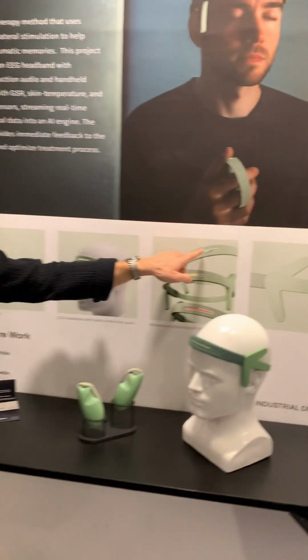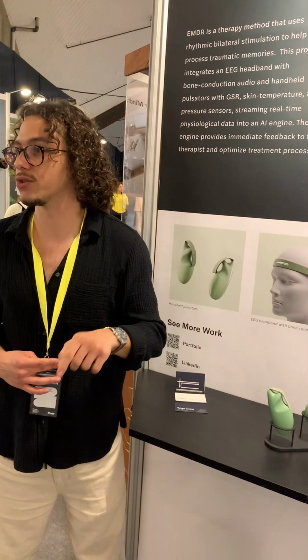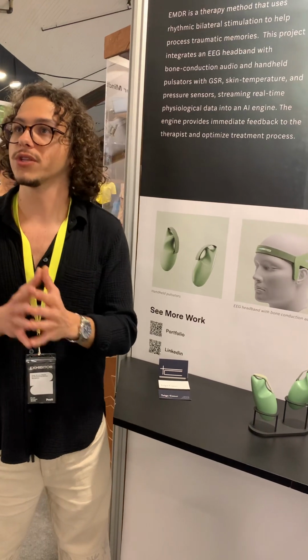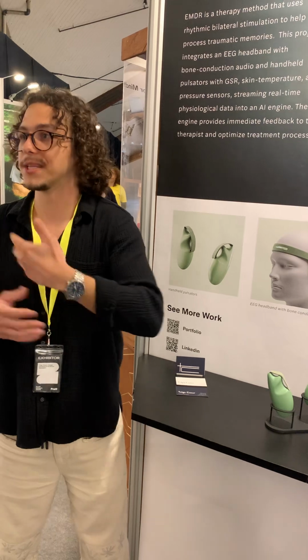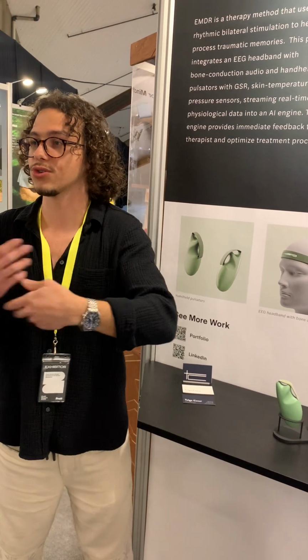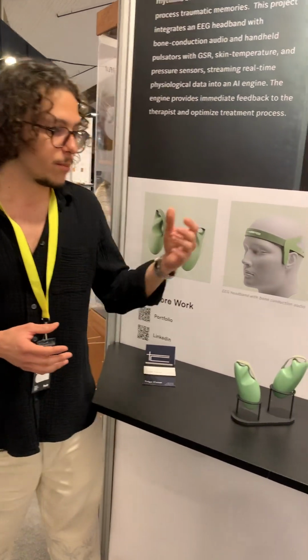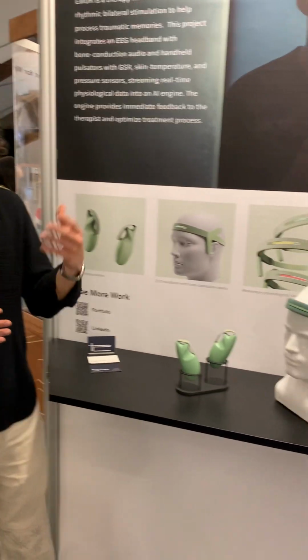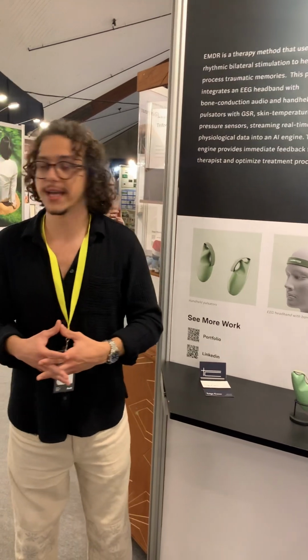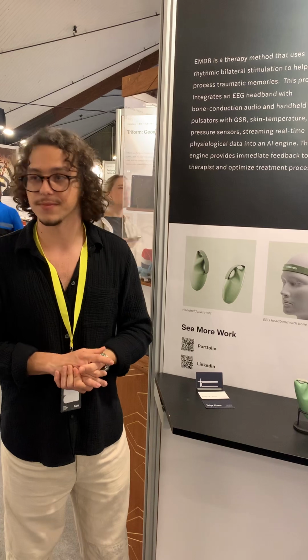It also indicates how much time is left for the session, because these sessions are done from 30 to 60 seconds each, and then after the session there's a talk between the therapist and the patient, and the process continues for about an hour. So it is really important to have both an ergonomic and comfortable design, and one that won't distract the therapist throughout the session. So basically that was the entire process of how I came up with this idea.